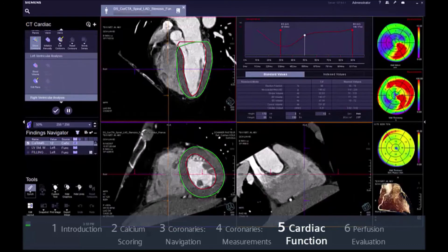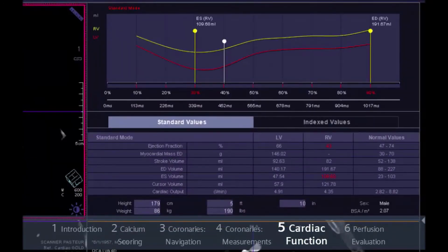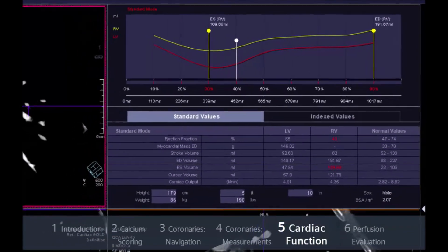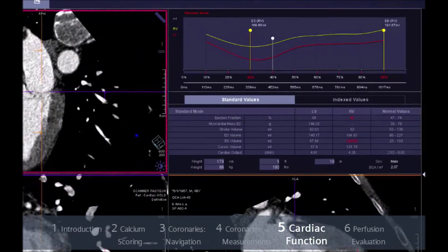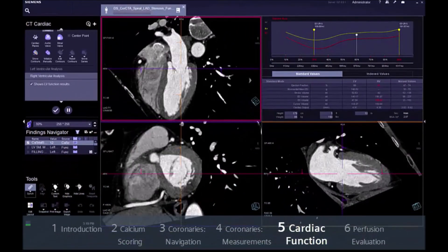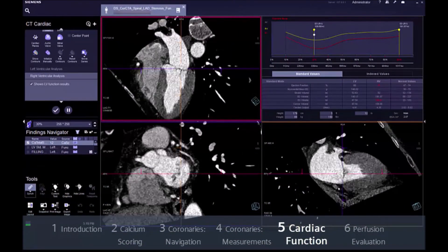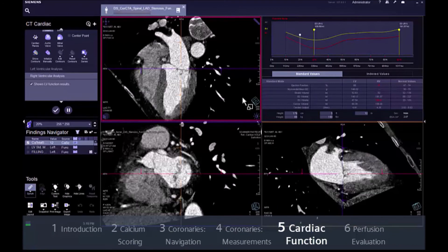CT cardiac function allows you to read and diagnose CT angiography images for both the left and the right ventricle and mark for further archiving. Local left ventricular function parameters such as wall motion, wall thickening and wall thickness are visualised in an easy-to-read AHA compliant 17-segment model.